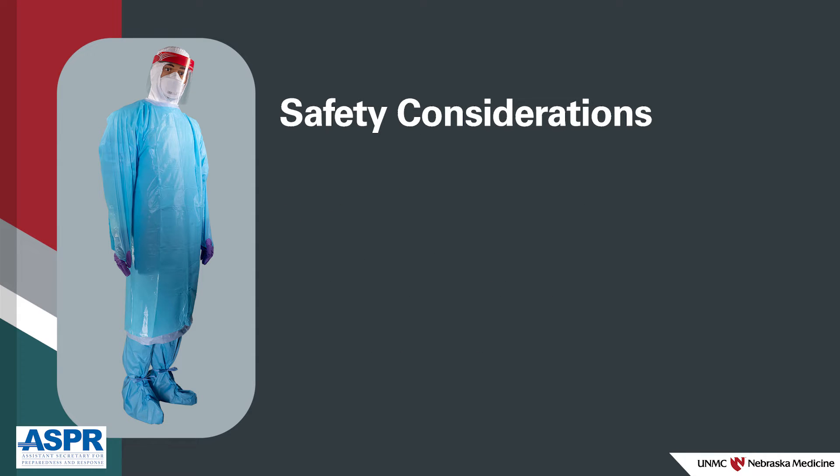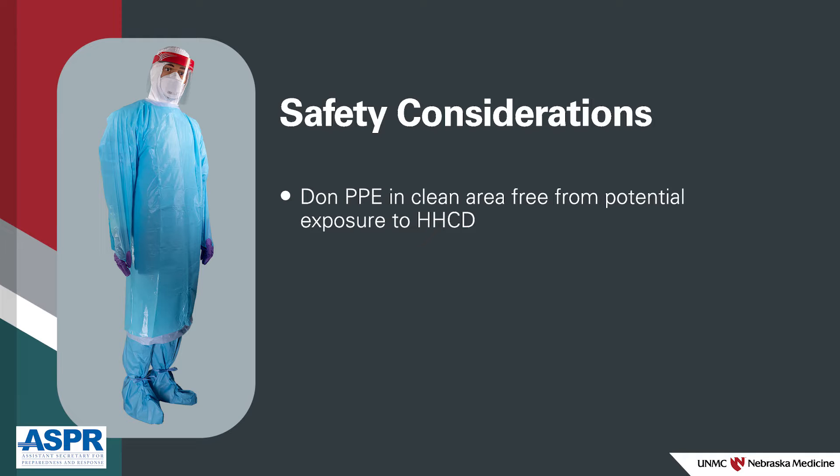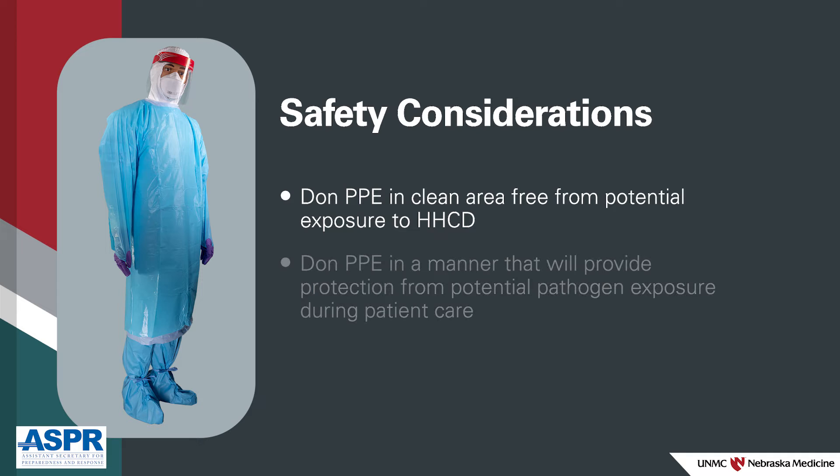It's important to don PPE in an area that is clean and free from the potential for exposure to the HHCD. It's equally important to don the PPE in a manner that will protect you while you provide patient care or perform activities that could expose you to the pathogen.